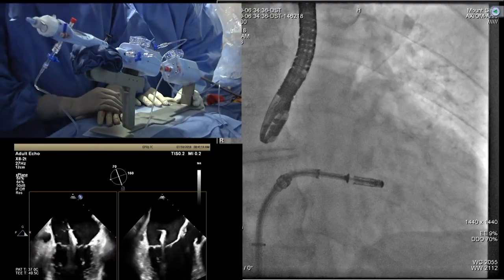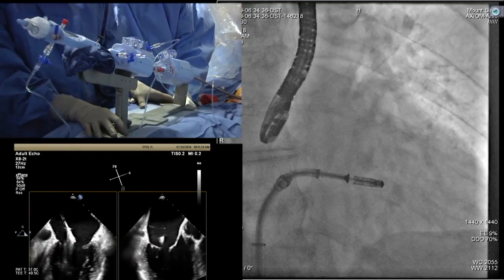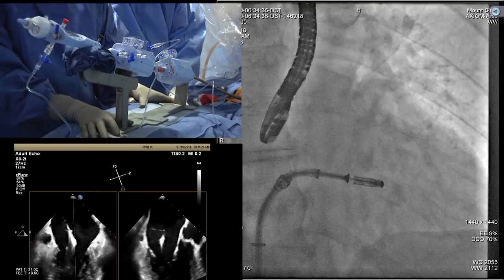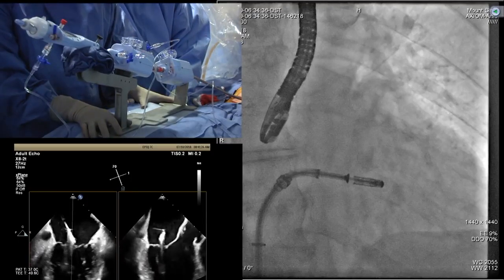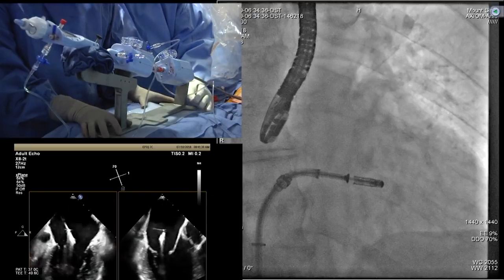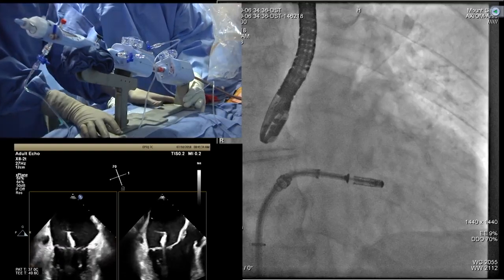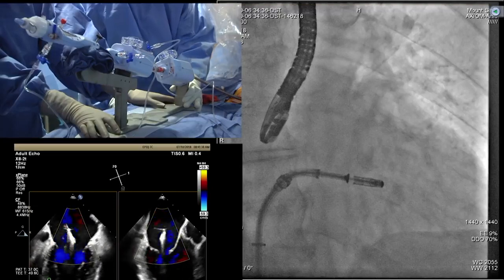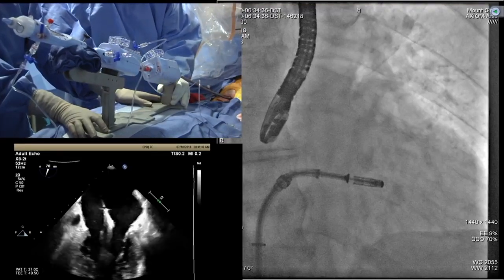So I'm bringing it a little bit medial. To do medial-lateral, you move the stabilizer. So I'm bringing the stabilizer back, so we are more medial. Okay, see that? Now we are coming a little closer. Gila, put some color so we know we are on the right part. Yeah, see? This is very important, that this is exactly where the jet is. Okay, good.